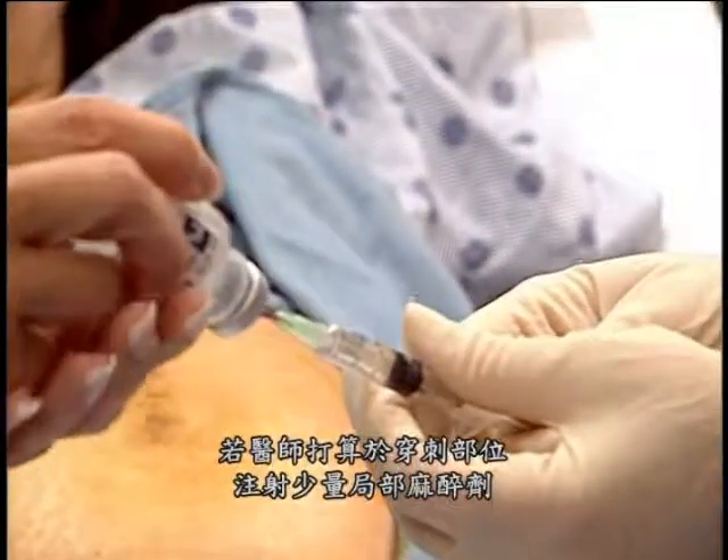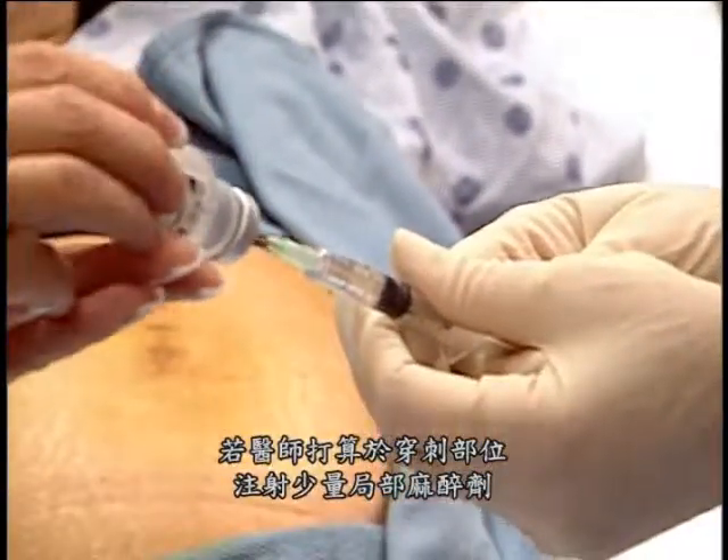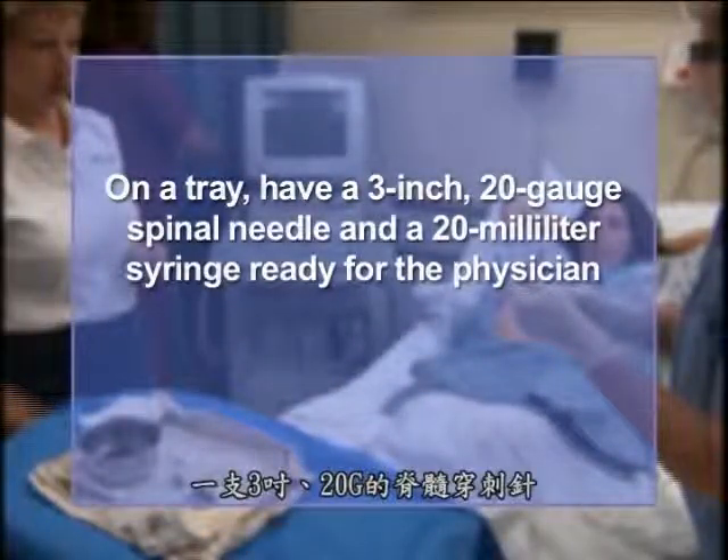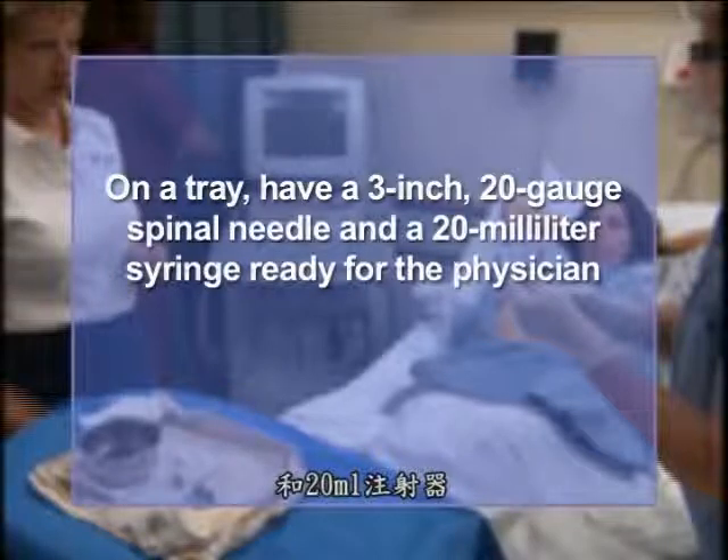If the physician plans to inject a small amount of local anesthetic at the site, prepare the woman. On a tray, have a 3-inch 20-gauge spinal needle and a 20-milliliter syringe ready for the physician.